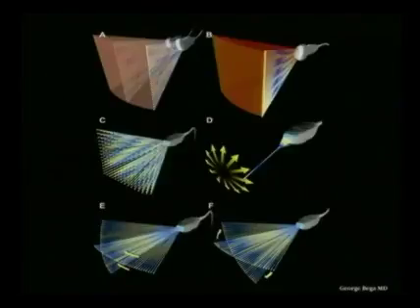And as I mentioned before, we can create small mini movies, small AVI files, with the rotation of these files. So this is a diagram just to show you the main modes. In A, you have a normal freehand acquisition of a volume. In B, there is a mechanical acquisition of a volume. In C is the matrix array, and D, E, and F are all matrix array capabilities.